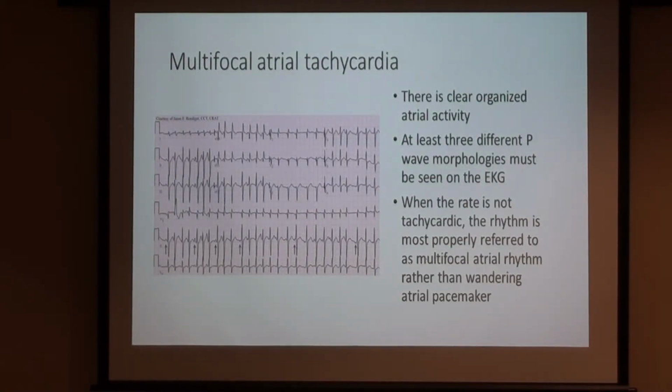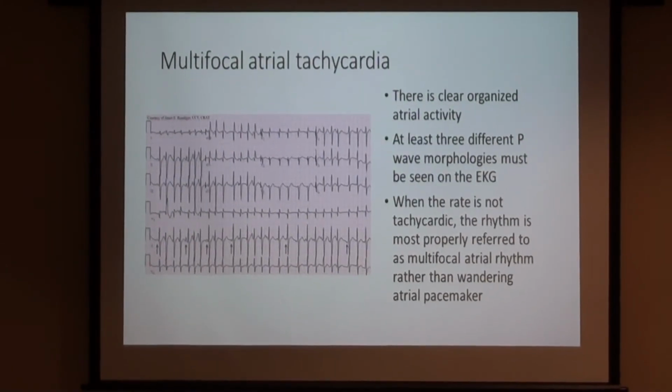But wandering atrial pacemaker is something that people will use sometimes to refer to multifocal atrial rhythm, and that is more rare than type 2 second-degree AV block. Just to clue you in about that. In fact, I've seen it once, wandering atrial pacemaker. That's pretty uncommon.